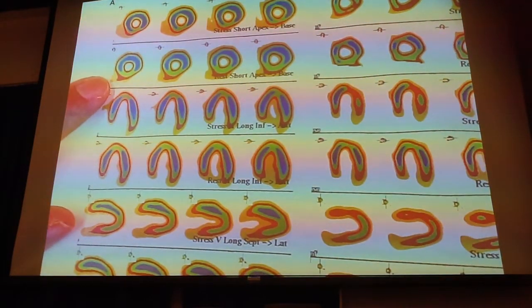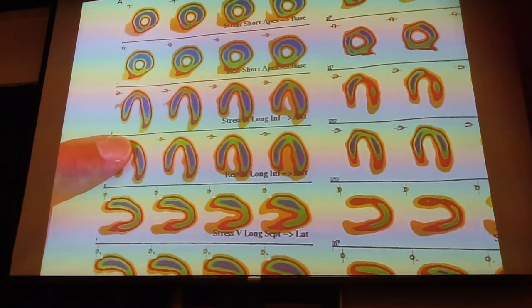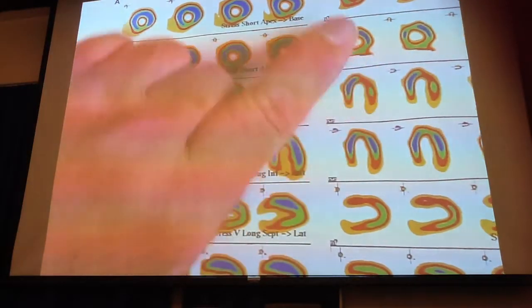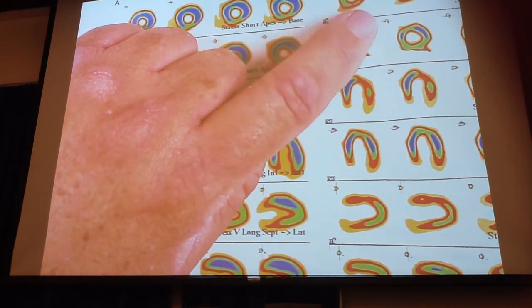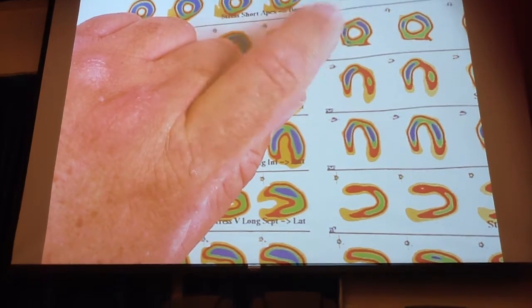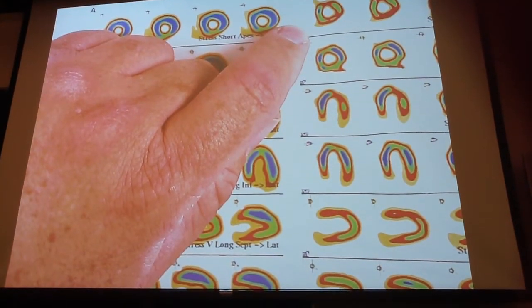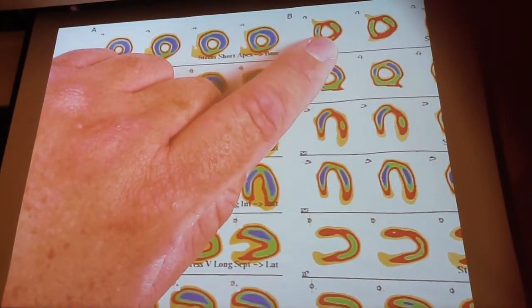On these color displays, you need to have a code that tells you what each color represents. So if red is 100 counts per pixel, then in this particular case every change of 20% results in a different color. Red might be 100%, orange might be 80%, yellow might be 60%. For every 20% change, the computer assigns a different color.